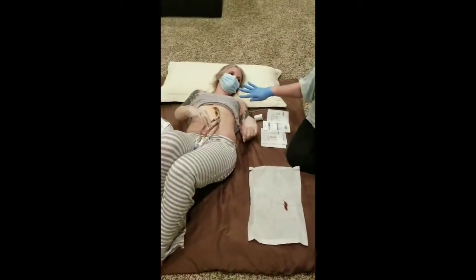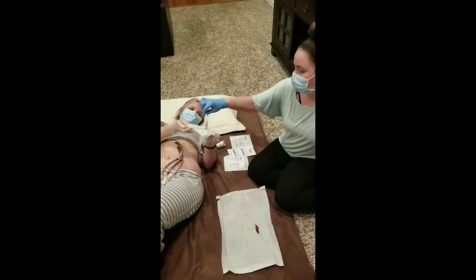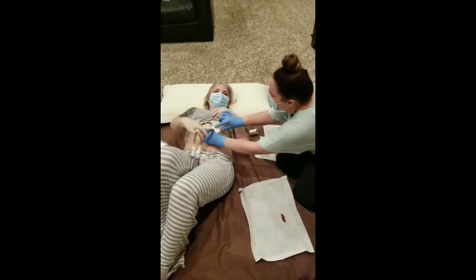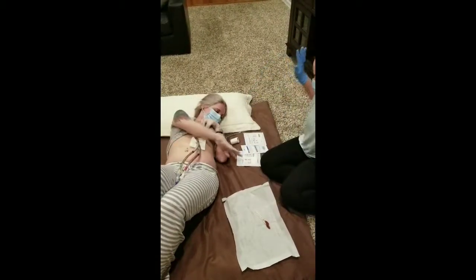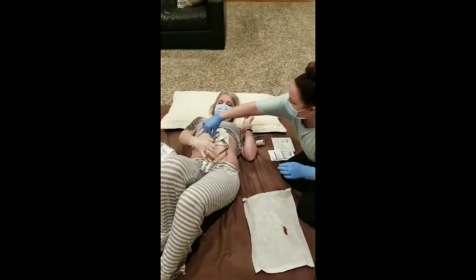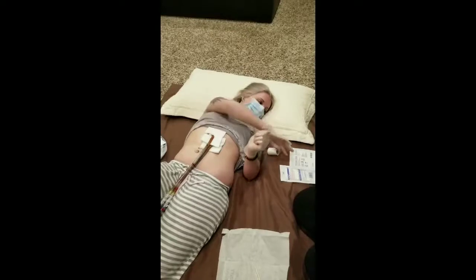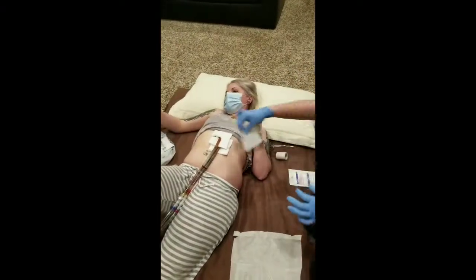You know it's dry when the shininess has gone away, and it's looking like it's dry. Angel's going to go ahead and open up the gauze sponges. I'm going to be really careful not to touch any of the packaging and in general try to touch as little as possible. This is something we do every day — it's part of our bedtime routine. I'm going to put a little layer of gauze.